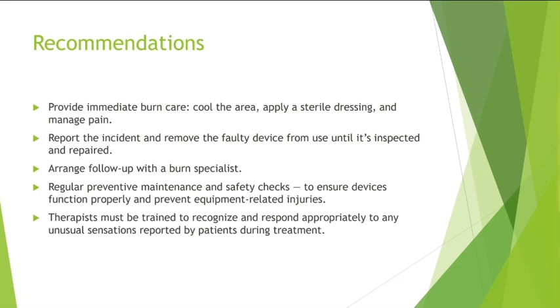Number two, the incident must be reported immediately. The device should be taken out of service until it's fully checked and fixed. Number three, the patient should be referred to a burn specialist to ensure proper follow-up and recovery. Number four, all therapeutic equipment needs routine maintenance and safety checks. This kind of preventive maintenance helps detect hidden problems before they can cause any harm.